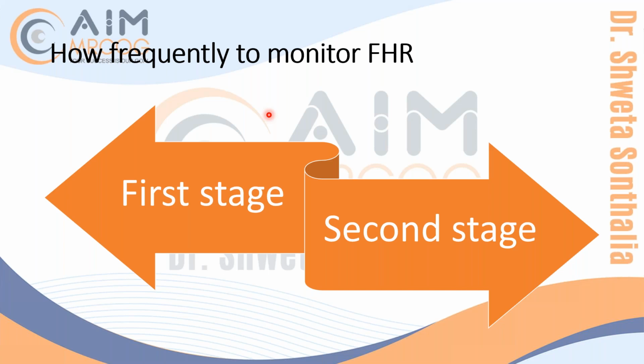There you're trying to understand if there is variation in the fetal heart or not. Sometimes you're hearing 140, sometimes 145, sometimes 150, and sometimes you might be listening to only 120 continuously. So if you're listening to 120 continuously and it's not changing, is it a good thing or a bad thing?